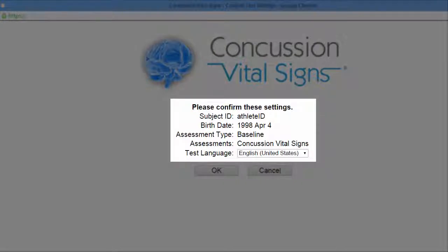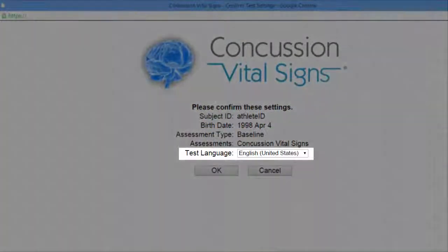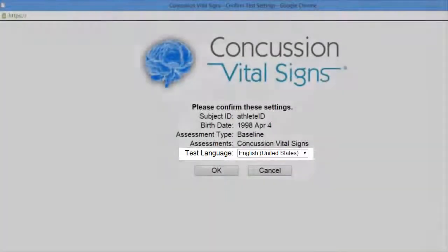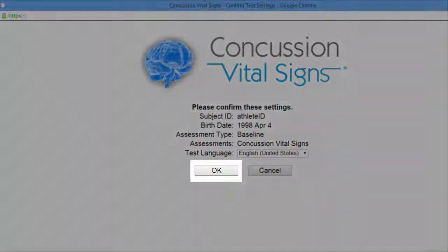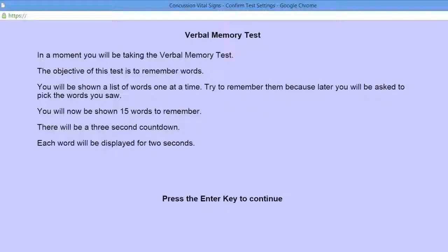You'll get the ID, the date of birth, as well as whether it's a baseline. You do have an option of changing from English to Spanish. Make sure the athlete is ready to begin the test and click OK — the test will begin.